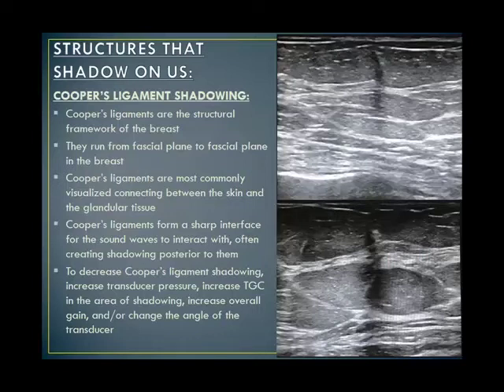We cannot. Nope. The only time we ever see the lymphatic system is when we look at lymph nodes. We can see lymph nodes, but that's all we can see. We can't see lymphatic vessels or anything like that. We can see the result of lymphatic vessels. Like when cancer invades the skin, it obstructs the lymphatic vessels in the skin, which causes edema on the ultrasound. So you start getting a really thick skin layer, lots of edema inside of it. We'll learn later when we get into pathology what edema looks like on ultrasound. But no, we can't see the actual lymphatic vessels themselves.